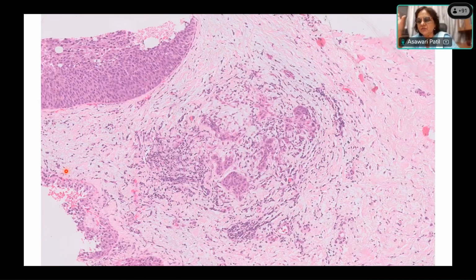If you want to measure the invasive focus, how do you measure it? And like a simpler way. Not every time we are going to mark it and measure it. Is there any simpler way to measure it? And why is it important?